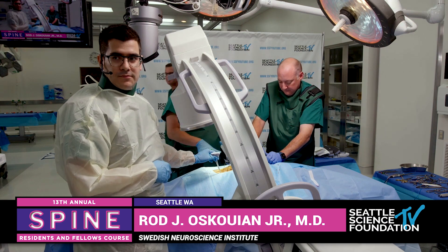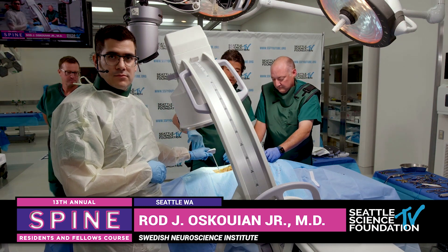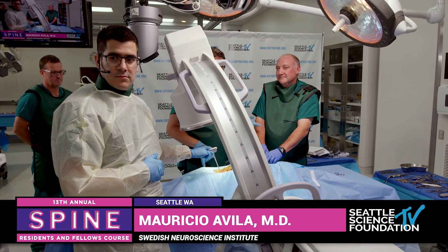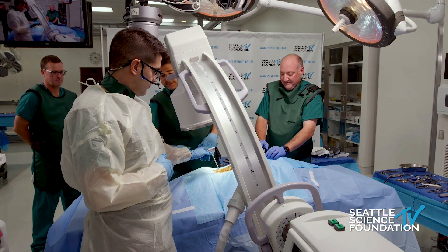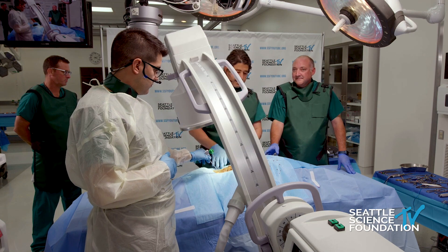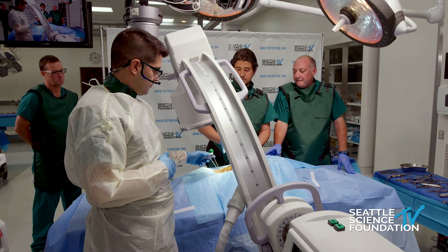So can you guys see what we're doing? We've put in some thoracic — I'm here with Mauricio, one of our fellows here at Swedish, and then we have Will and Victor, and behind me is Max from SpineArt. What we're doing here is a thoracolumbar percutaneous fixation and we've put in these nitinol wires.